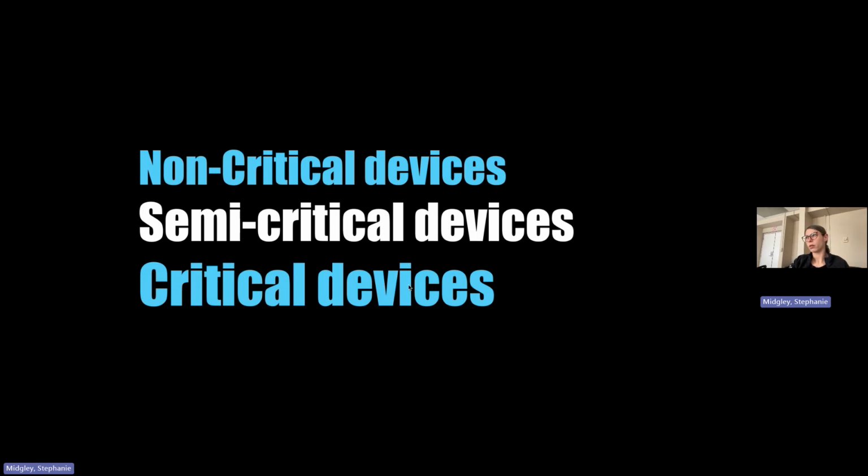So these are like your esophageal ultrasounds that they do. This is like your intracardiac ultrasounds for the lumens and stuff like that.